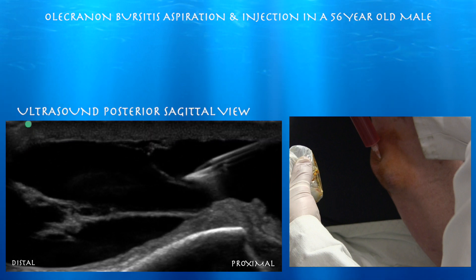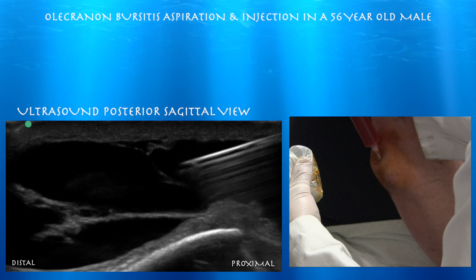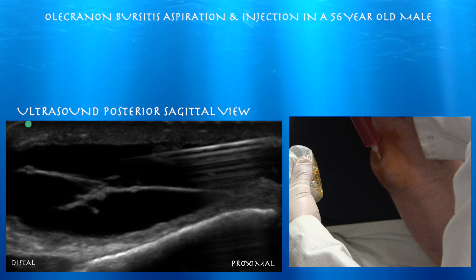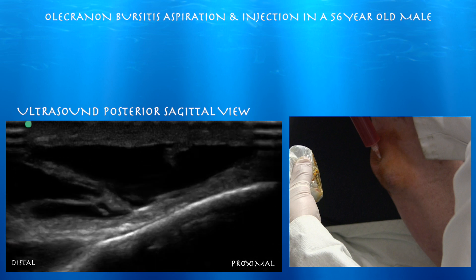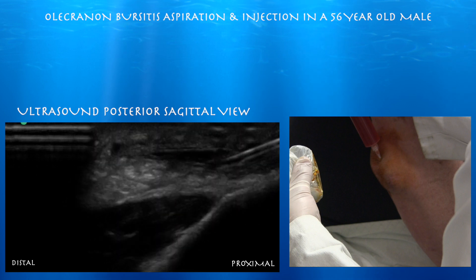Here we are starting the procedure. It's pretty hard to miss this one. Ultrasound can help you because if you can't get it all because of the septum, then you can just breach that septum and drain each compartment separately. It's pretty much a thin, bloody kind of liquid within here, and it drained pretty easily. We're trying to breach the septum just to make sure we get all the compartments of this olecranon bursa drained — which is again how ultrasound comes in handy.